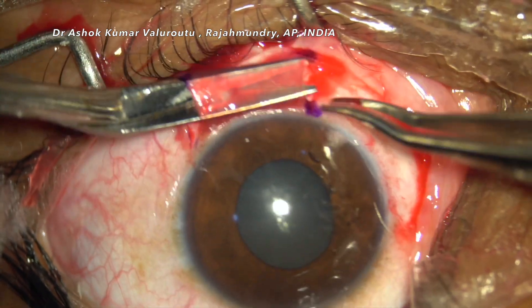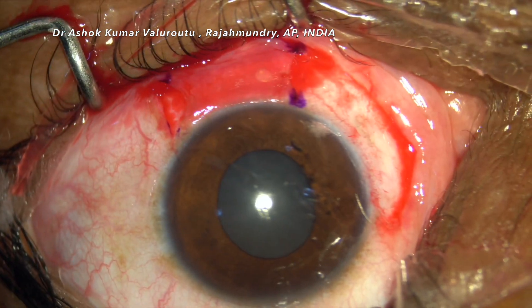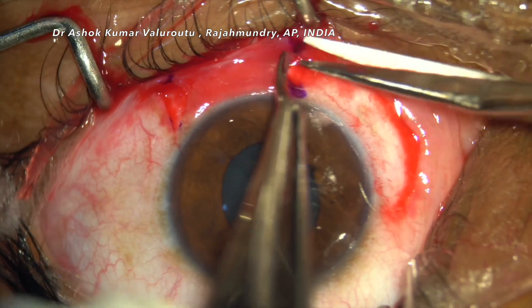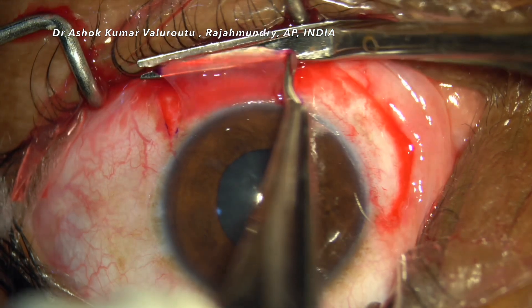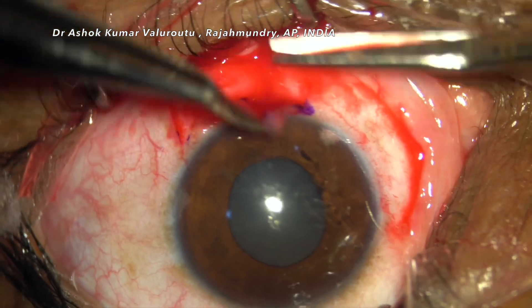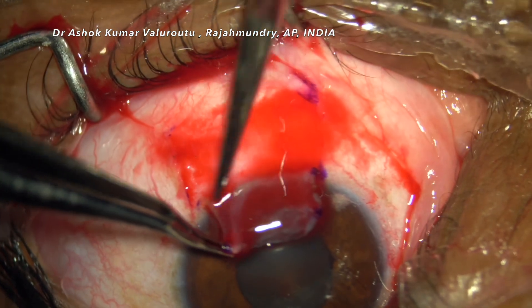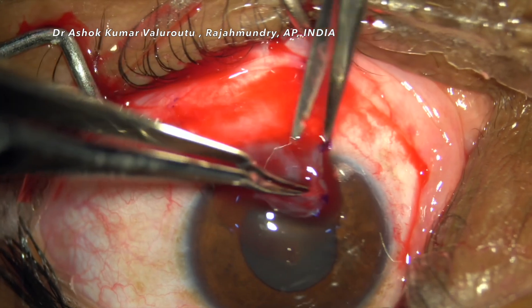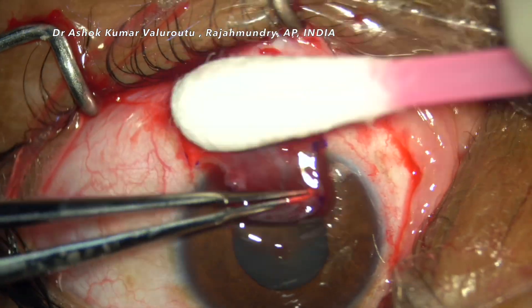Once the blunt dissection of conjunctiva is complete, we will be removing the conjunctiva. We make sure that it is incised all the way to the limbus so that a part of the limbal stem cells are included in our graft.